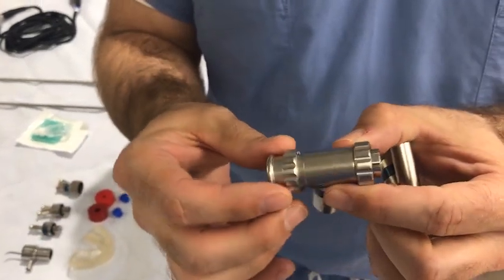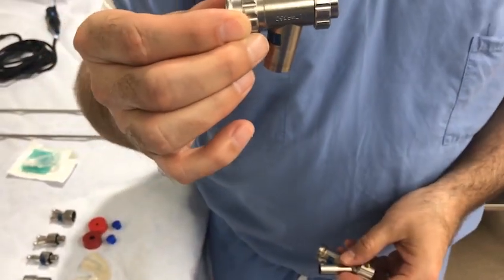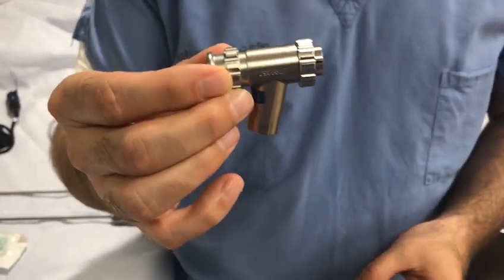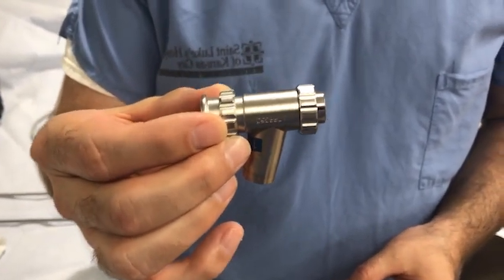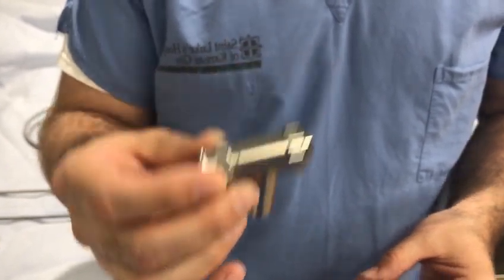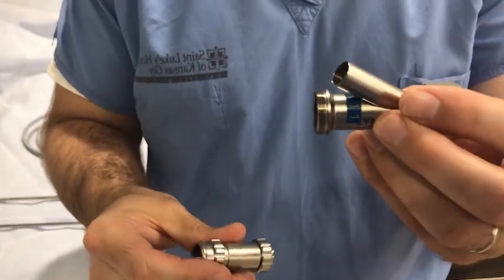Assembly of the rigid scope begins with attaching the anesthesia connector to the universal instrumentation barrel. The two pieces lock together over the corresponding threads and are secured to prevent dislodgement.